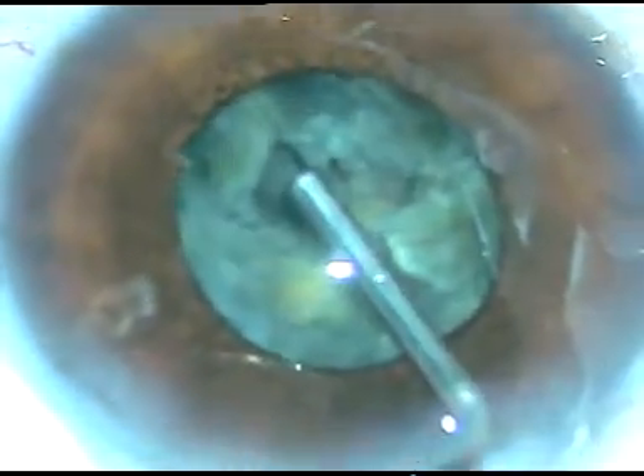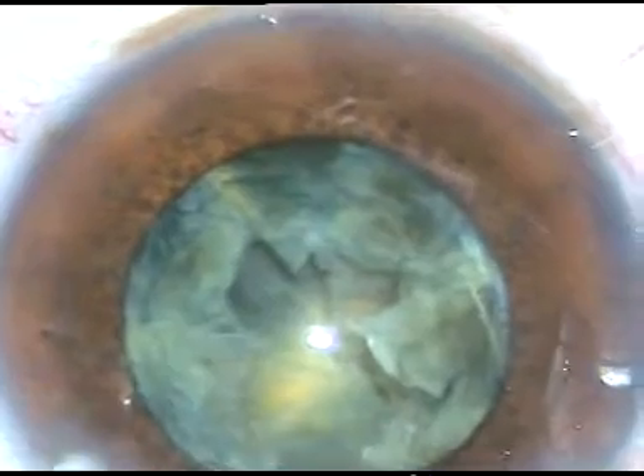Now I inject methylcellulose again — this is viscoelastic. The pupil has dilated to some extent. Now I take two instruments: a chopper in my left hand and a Sinskey hook in my right hand, and I am trying to manually separate the fragments and make them free. And I am able to do that. The fragments are free.